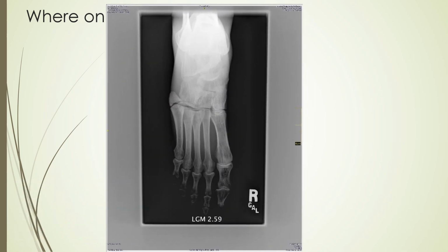In the overexposed image, the pixels in the thinner portion of the foot, the phalanges, are no longer correctable. There is not enough contrast from one portion of the phalanges to another for the computer to distinguish the density difference correctly. I call this effect density saturation. This exposure needs to be repeated. The mAs should be reduced by a factor of 16 times.